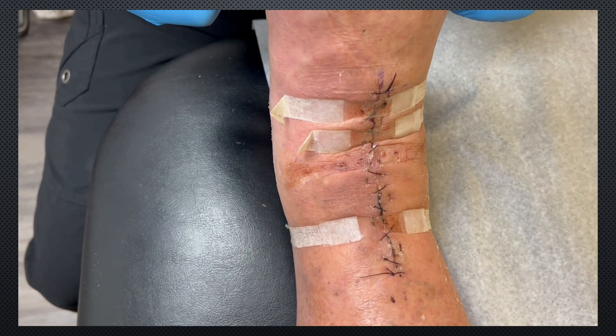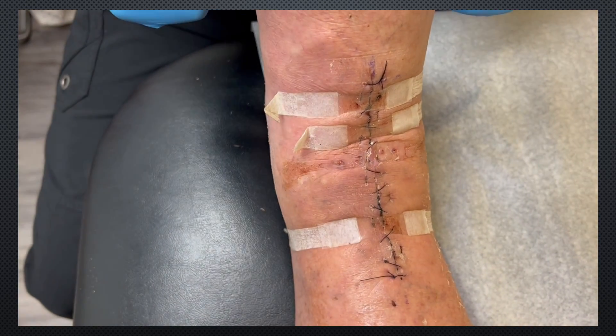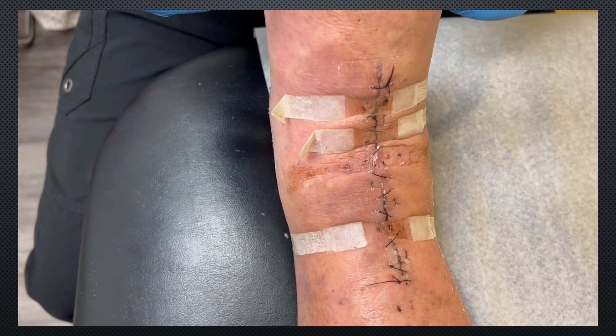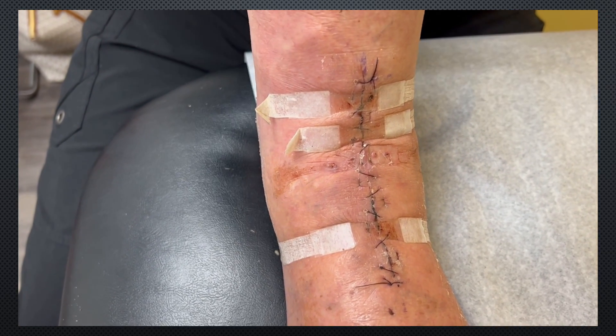You see what happens when we dorsiflex up — there's just a little more tension on that, especially the central portion of the incision right there, where it wants to kind of gap open. So we're going to take these off and get the stitches out, and then we'll show you putting them back on.